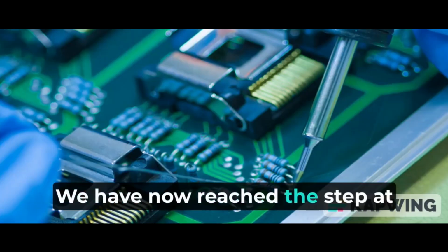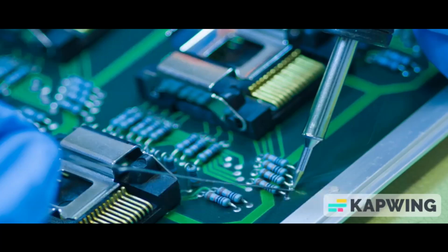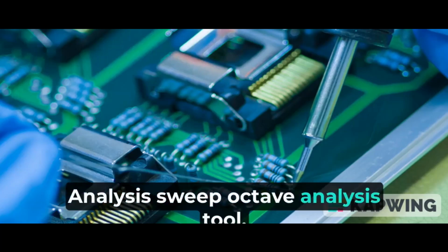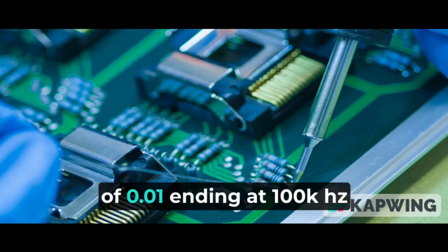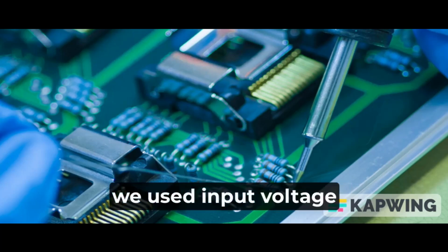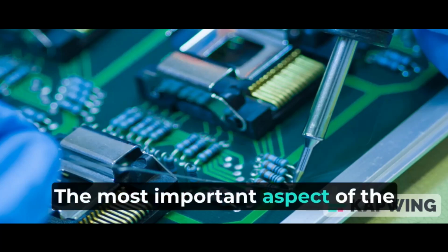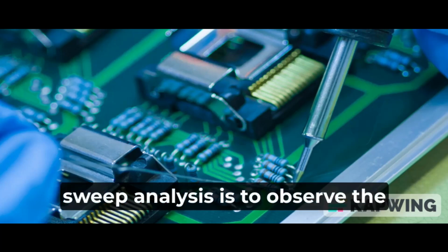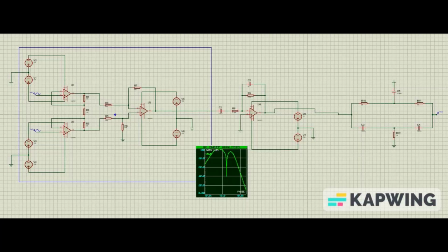We have now reached the step at which we test the components. Each component in the circuit was individually tested using the Proteus AC sweep octave analysis tool. We set the parameters to 100 points per octave, starting from a frequency of 0.01 Hz and ending at 100 kHz. We used an input voltage of amplitude 1 volt, but this value can be adjusted as needed. The most important aspect of the AC sweep analysis is to observe the shape of the output signals as the frequency changes. Now that we have designed all the components separately, it is time to put them all together.